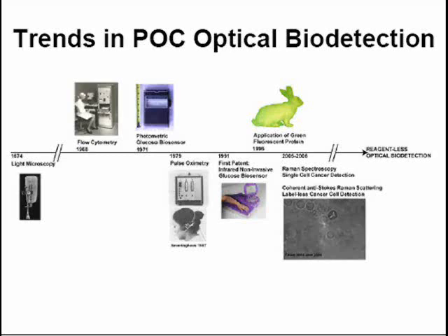In 1979, in Japan, development of the first pulse oximeter, thanks to developments in microprocessor technology, this device now provides clinicians with an alternative, or at least a complementary technology to blood gas testing. Of course, you can see here, relative to my previous examples, that the biosensor back in 1979 was considerably larger than what we have today.